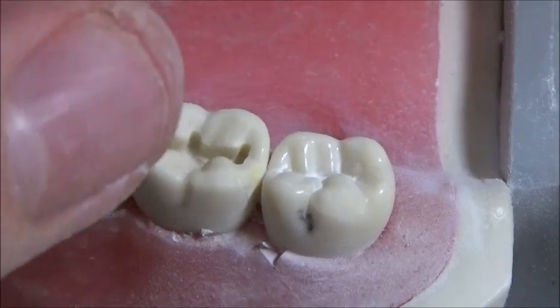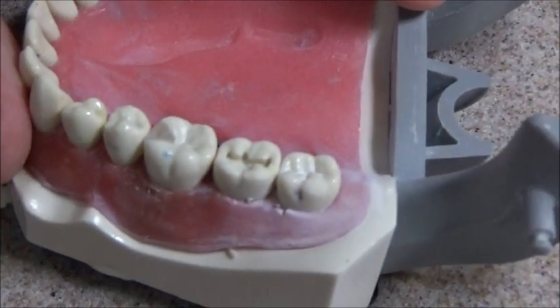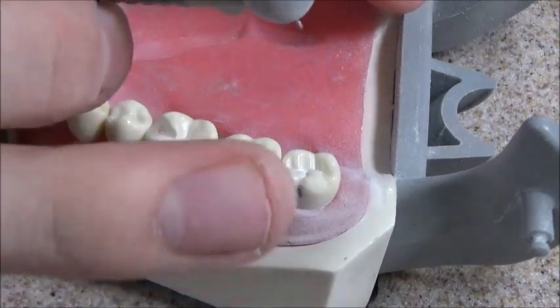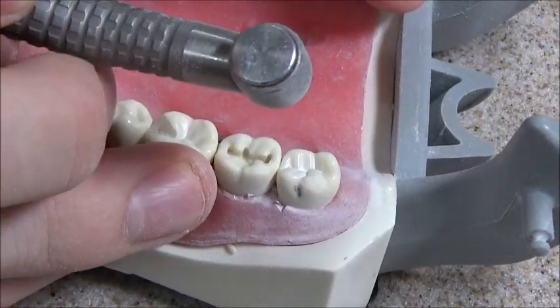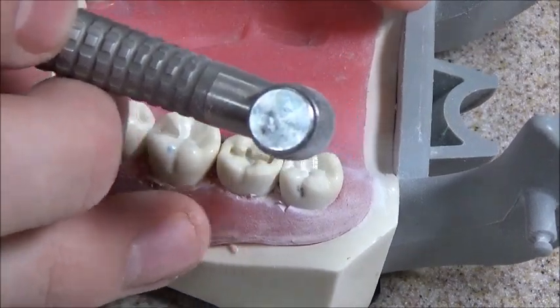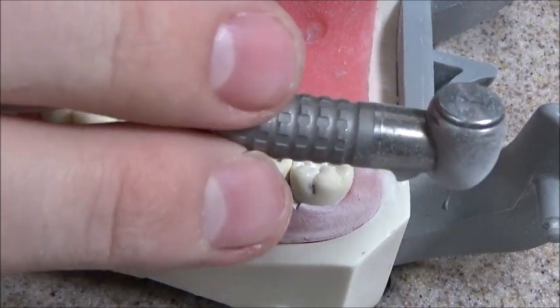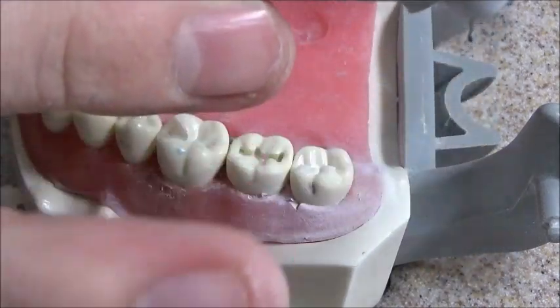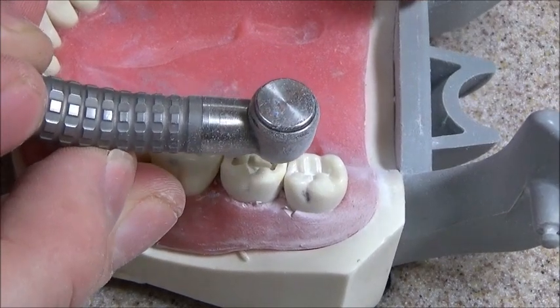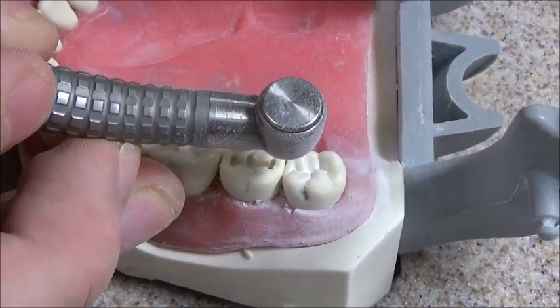One thing not really shown well on camera — I'll zoom out a little bit — is the placement of a good finger rest. When working on this area, my ring finger is placed on either the teeth or the gums right here on the patient. You want to go for the teeth, but use that modified pen grasp with a very firm finger rest, otherwise you just won't have that degree of control that you need.